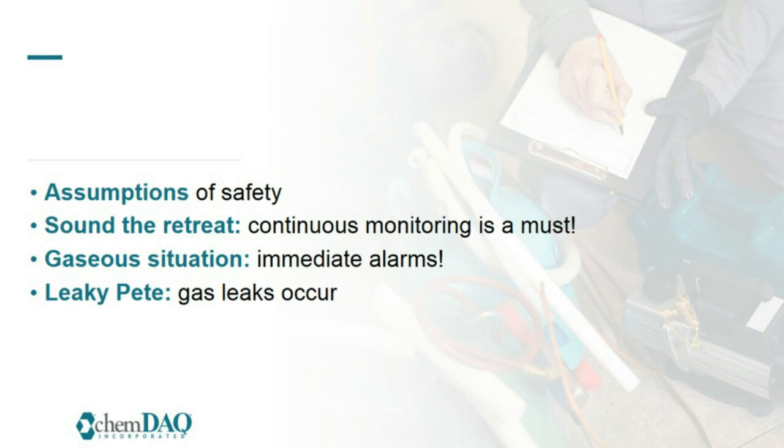Sterilizer manufacturers go to great lengths to make them as safe as possible. Still, releases of gas occur. It is vital that hospitals utilize continuous monitoring to keep employees safe. Monitoring your area once a year is not adequate.